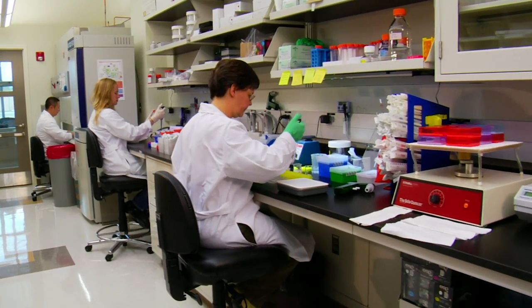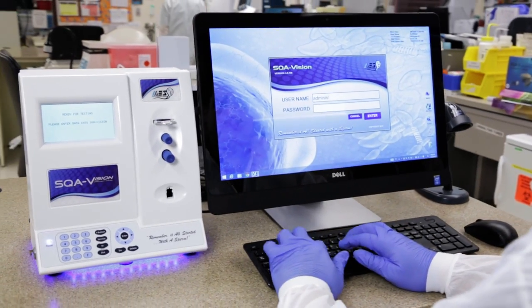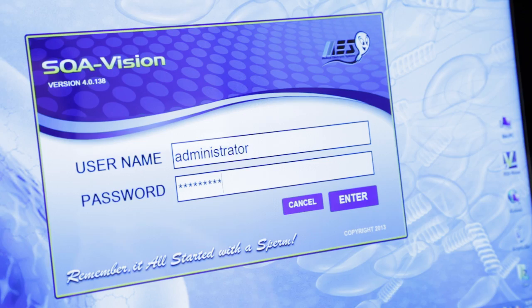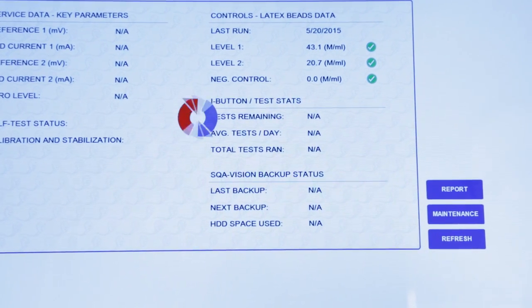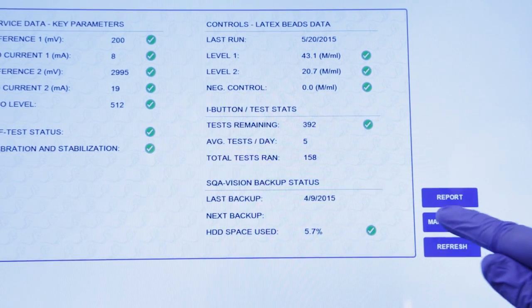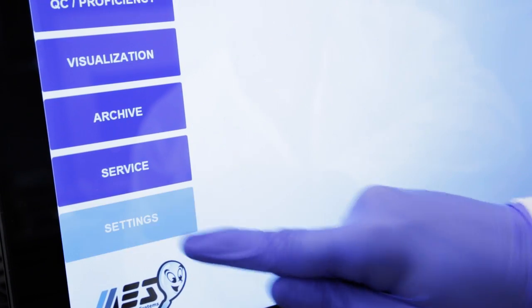From routine screening facilities to high-end IVF centers, the Vision offers a fast and accurate tool to meet a wide range of semen analysis and sperm preparation requirements. After logging in, the system will perform a fully automated calibration and self-test, then display your key reference parameters with shortcuts to your daily maintenance checklist and service information. The SQA Vision simplifies every aspect of the daily workflow.